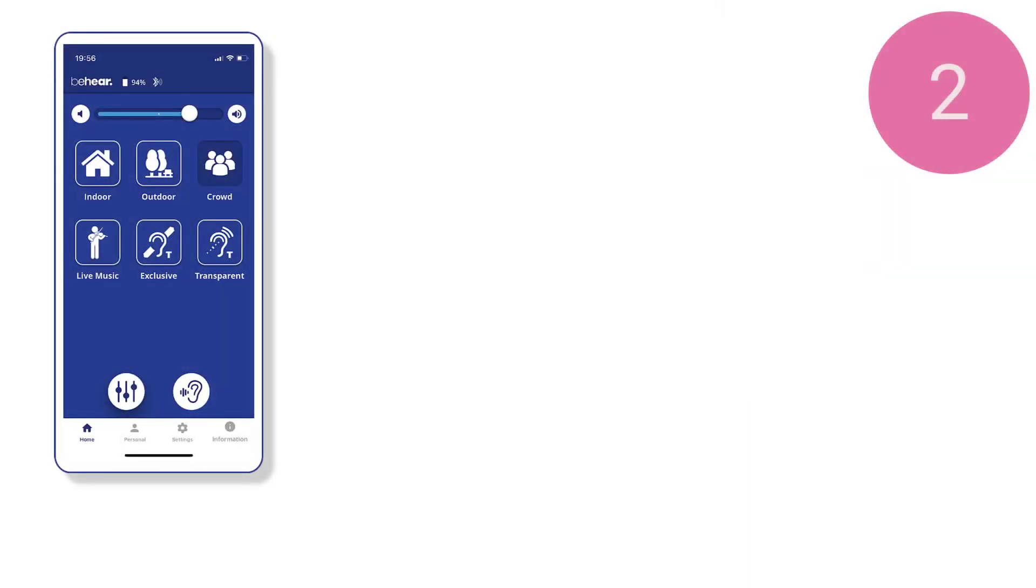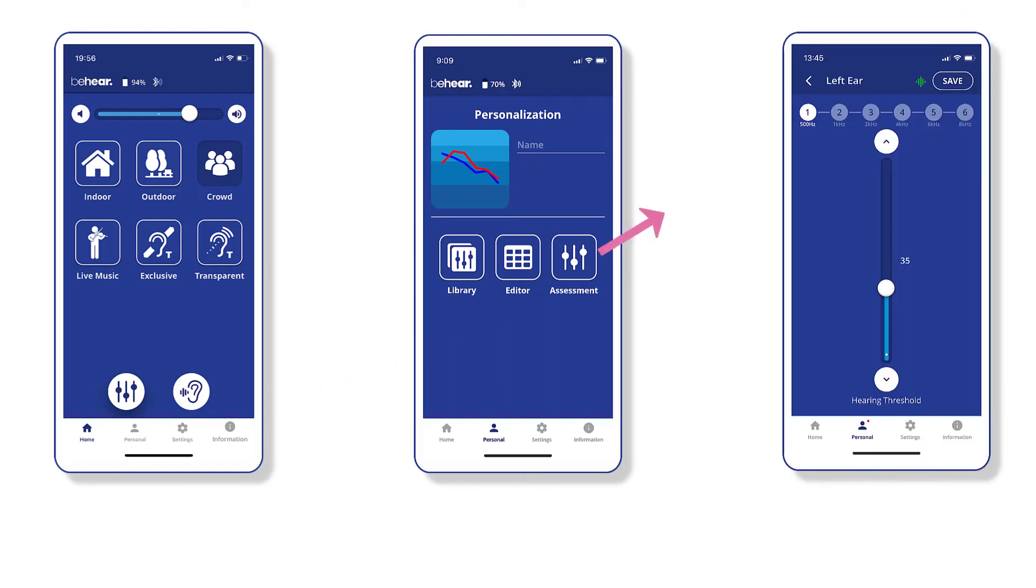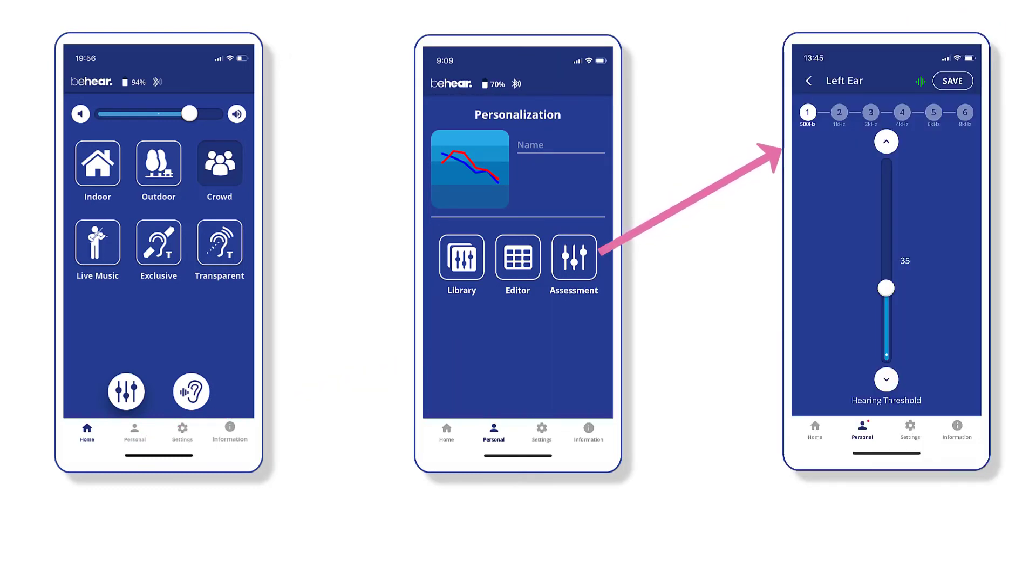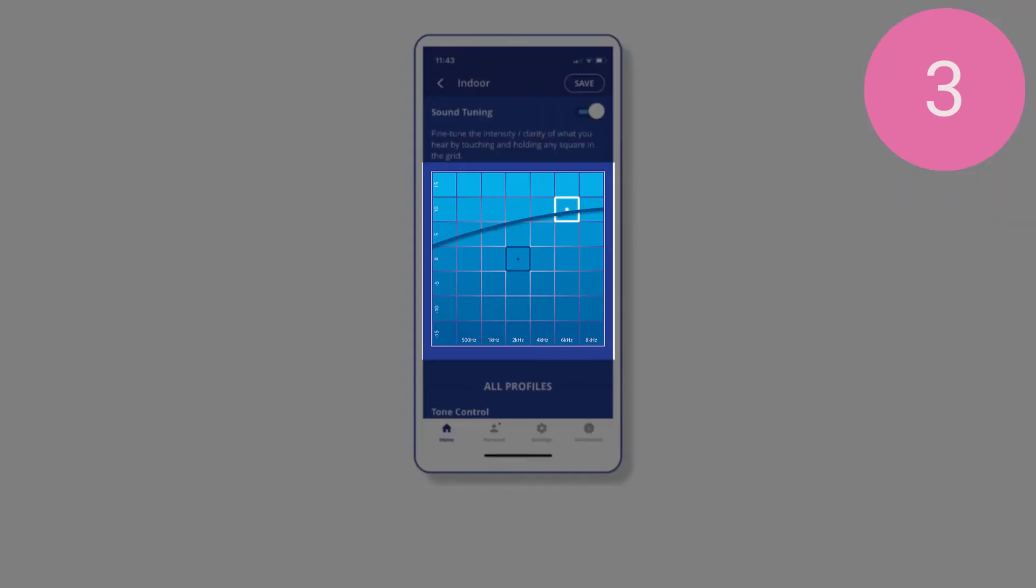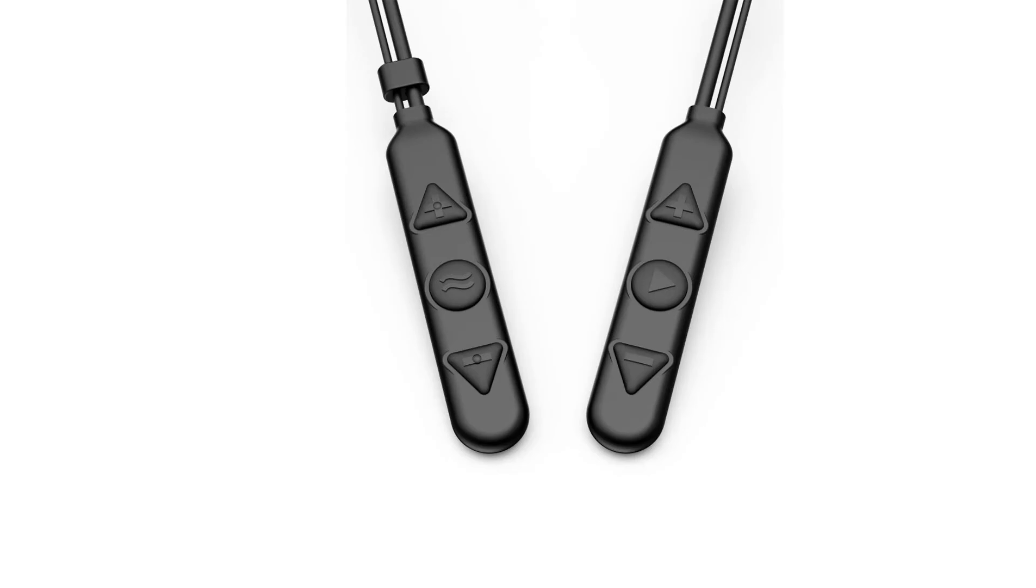By taking the hearing assessment in the BeHear smartphone app, which will personalize your hearing baseline. By using the sound tuning grid and noise reduction options in the same app.